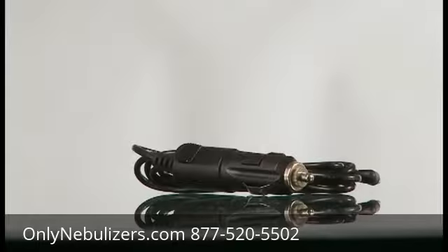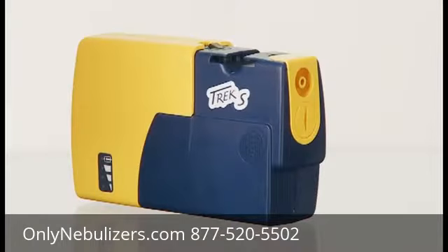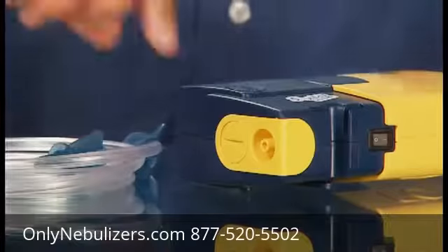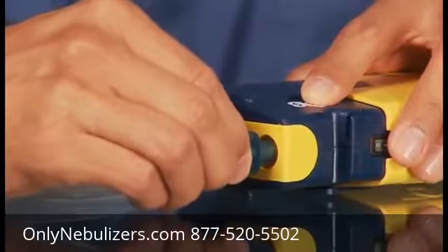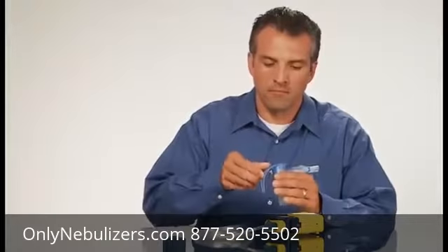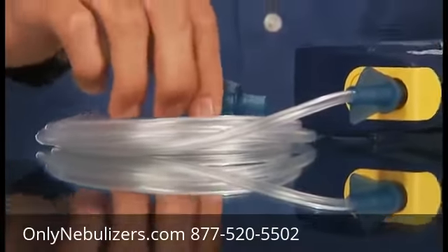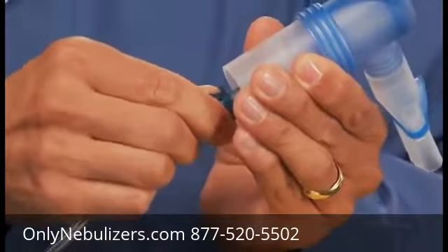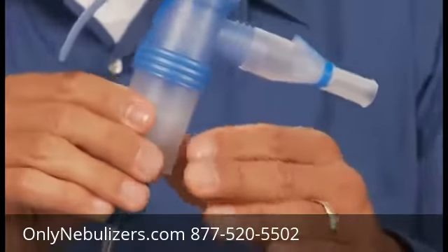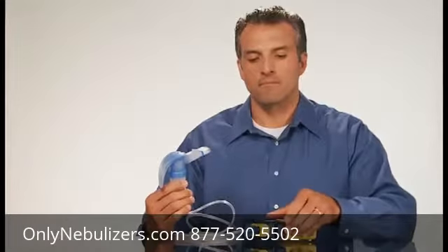The 12-volt DC adapter should be plugged directly into an appropriate vehicle outlet. Do not use while operating a vehicle. The optional lithium ion rechargeable battery is available to help maximize your freedom with portable treatments. Refer to your Trek S instructions for specific charging, use, and safety information. Connect the included wingtip tubing to the air outlet of the Trek S compressor. Be sure that it fits tightly. Pour your prescribed medication into your nebulizer cup as instructed by your physician. Firmly attach the other end of the wingtip tubing to the air intake of your Pari nebulizer cup.